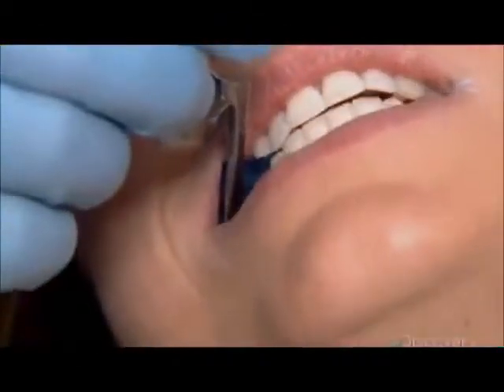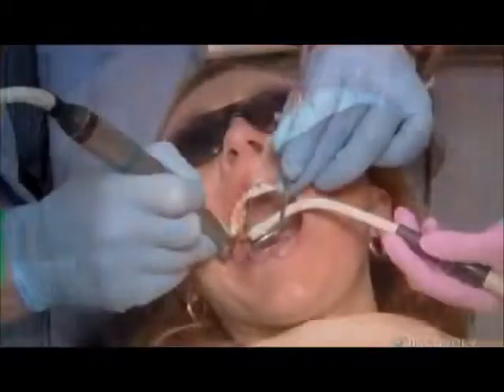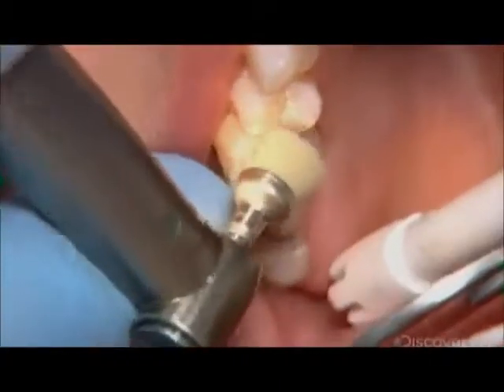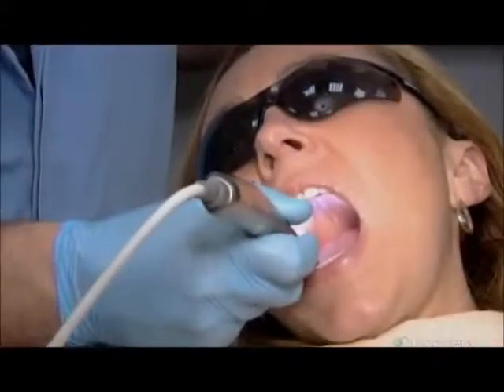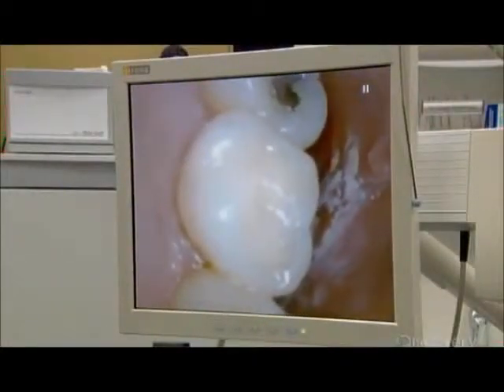He takes another impression of the patient's bite to confirm the new inlay is perfect. Finally, the dentist polishes the contours of the ceramic inlay. And it's time for the reveal — he uses the camera to magnify the new dental work for the patient's scrutiny.